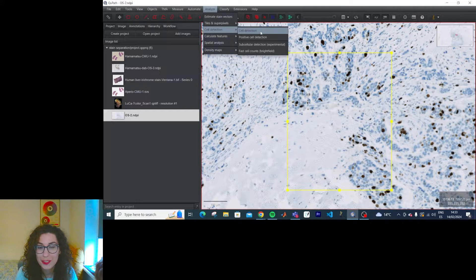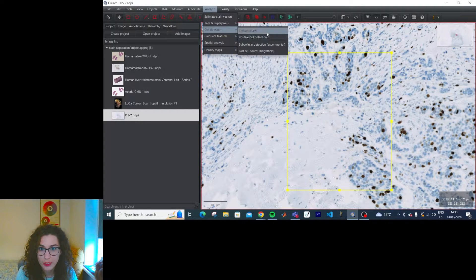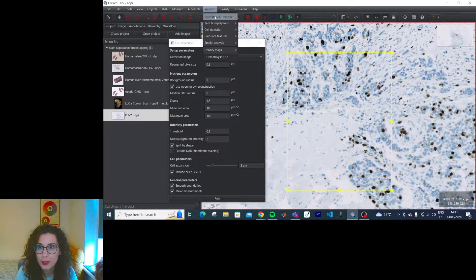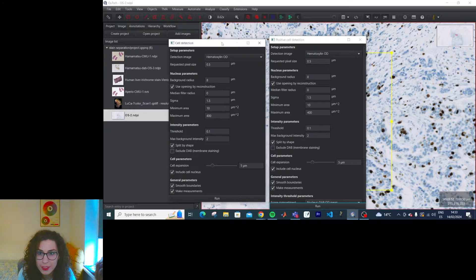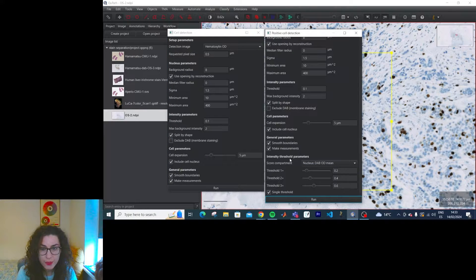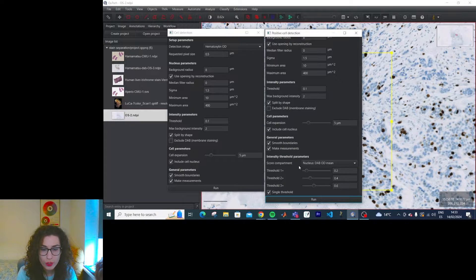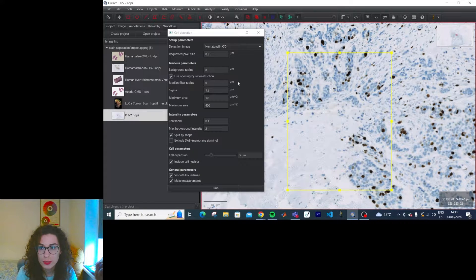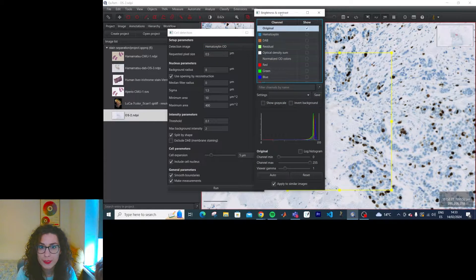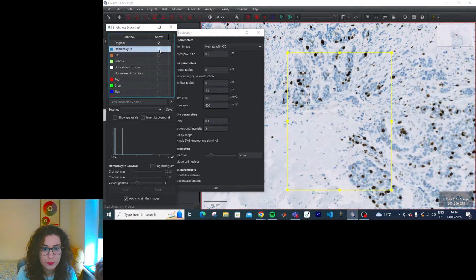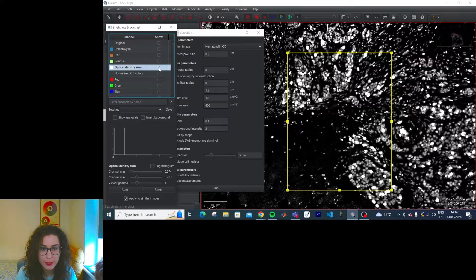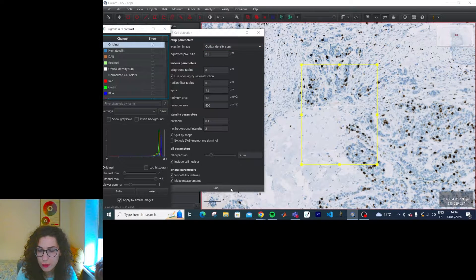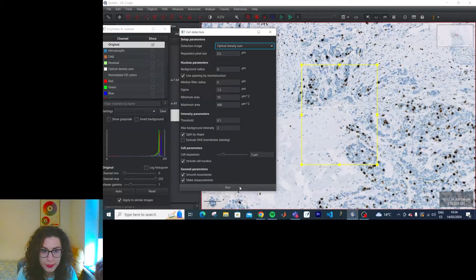And now analyze cell detection. So you can do cell detection or positive cell detection. Let's start with cell detection. Can I open two windows at the same time? Yes. Well, what's the difference then? So the difference is that for the positive cell detection you get an extra step of the threshold parameters to differentiate between normal nuclei and stain nuclei apparently. We're going to just do cell detection. We can choose the image we're going to be using. So it's either the hematoxylene or the optical density sum, which shows the nuclei much better. Let's use this one. And then let's just run it as it is. And then we'll change a little bit the parameters.